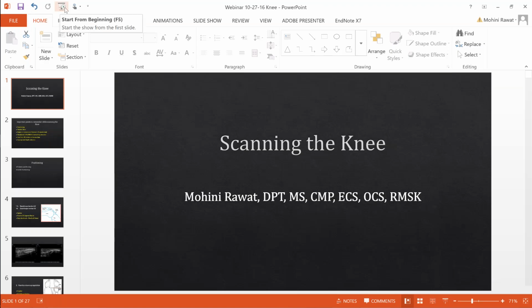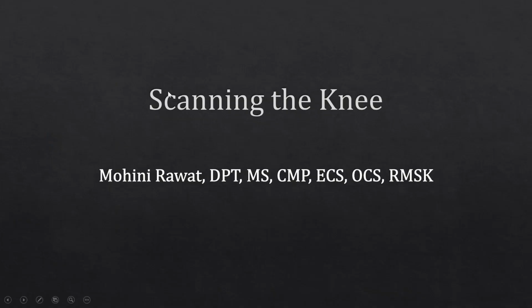Okay, so today's presentation is on scanning the knee ultrasound, and I'm going to talk about just normal sonoanatomy and some important points that you need to keep in mind when you're scanning the knee.